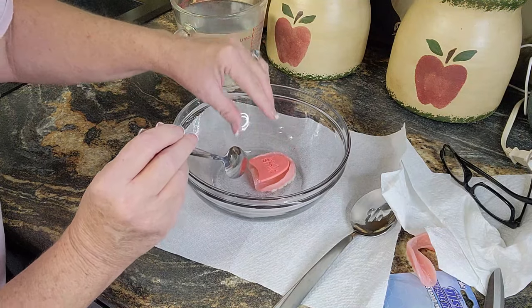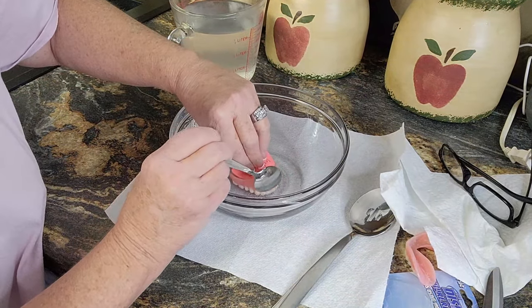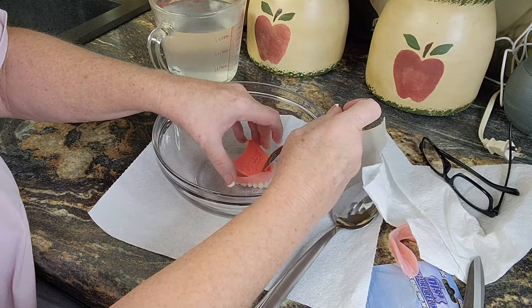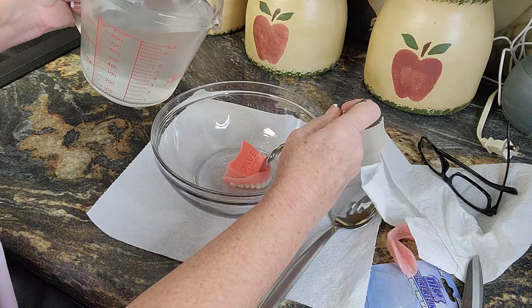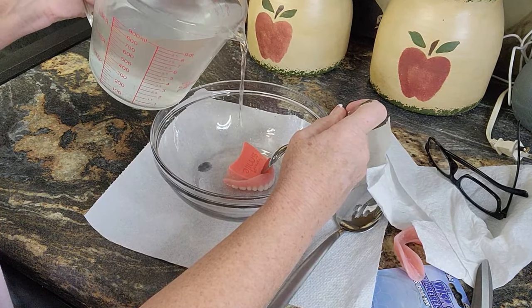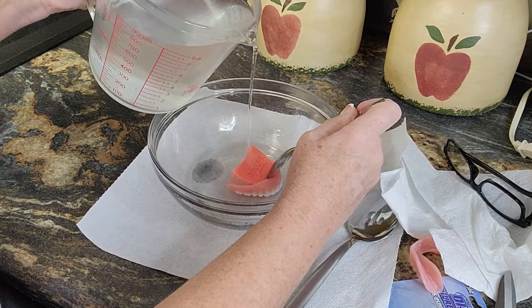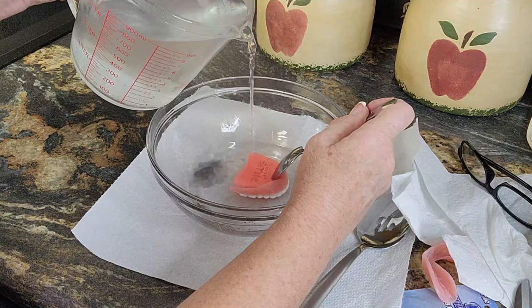I would like it right, whatever. Okay, hold this. I don't want it moving. All right, let me hold it right like that. Okay, can you see that? Now I'm gonna pour this hot water over top this thing on my denture. And it's supposed to, oh good God. Oh good grief. I don't foresee it. Oh, there it goes.